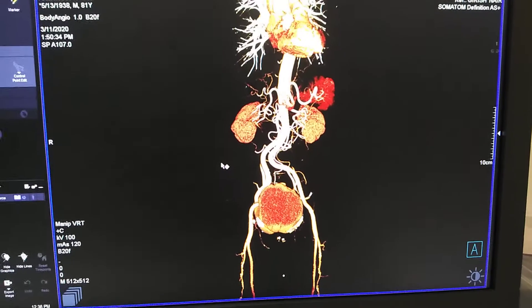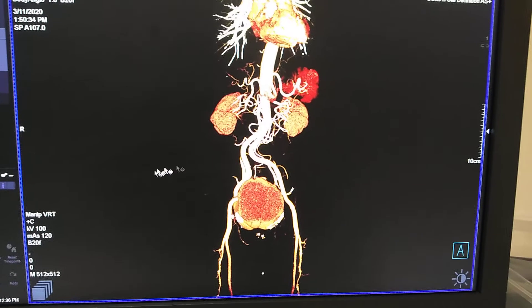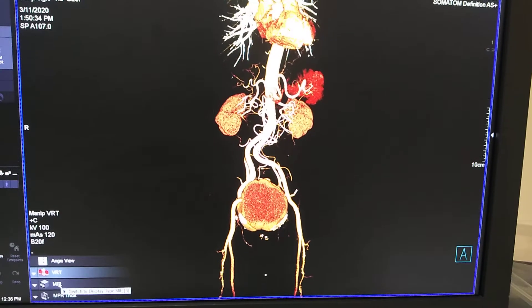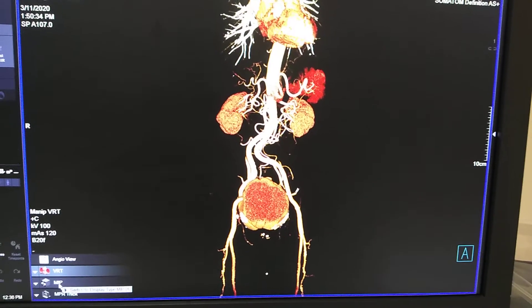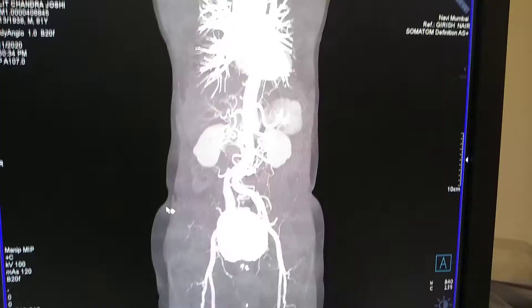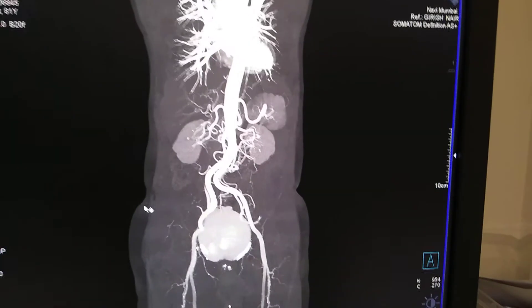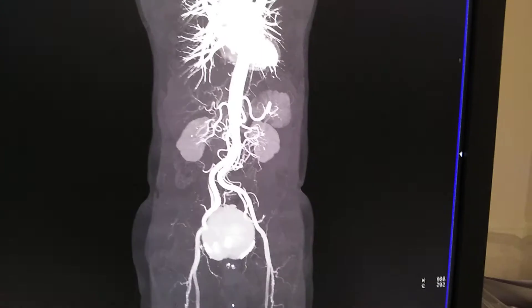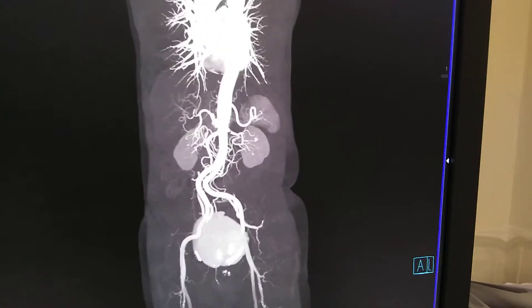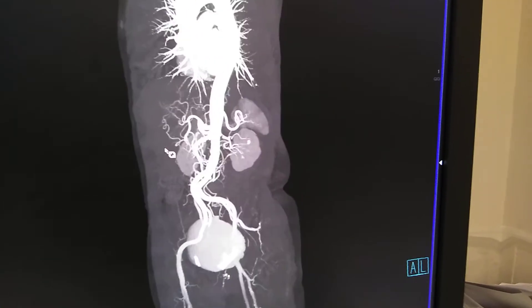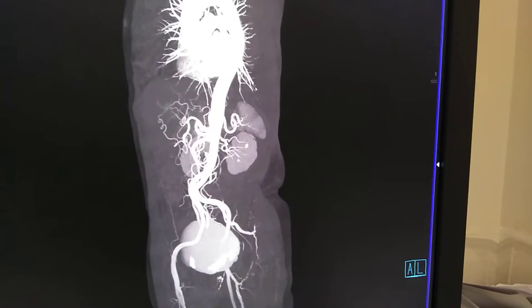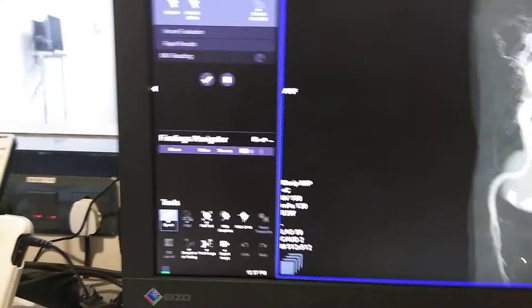You have to adjust the contrast and you can change it here to the MIP as well. You can rotate these images and simultaneously you can save these images from here.